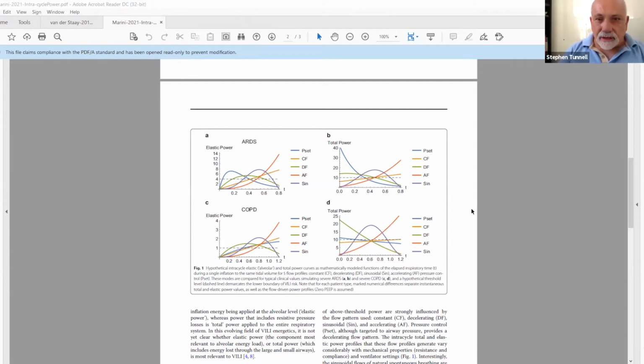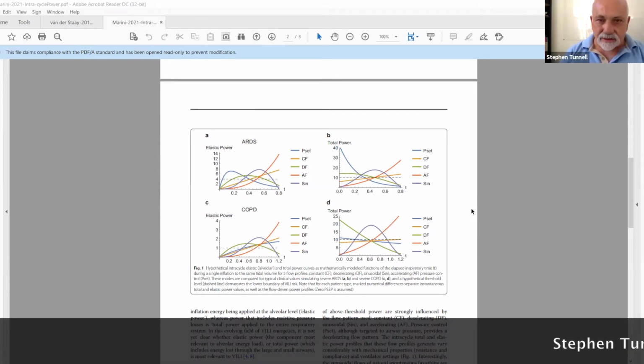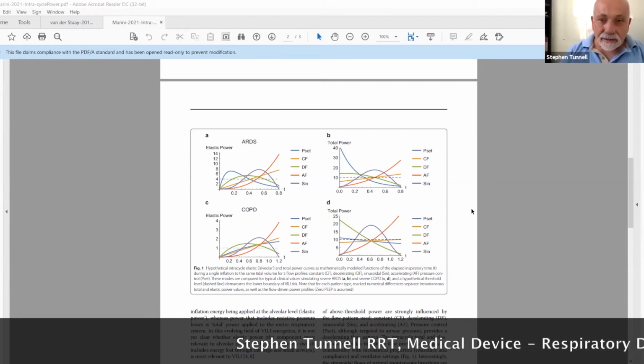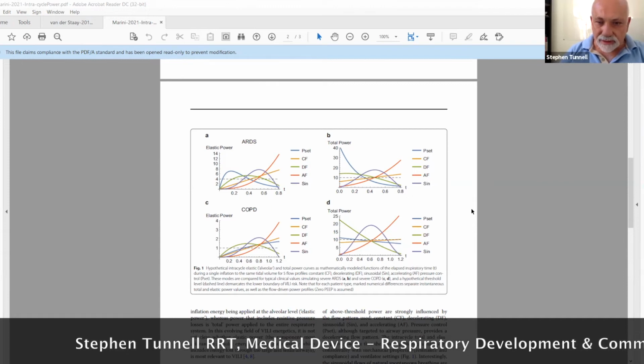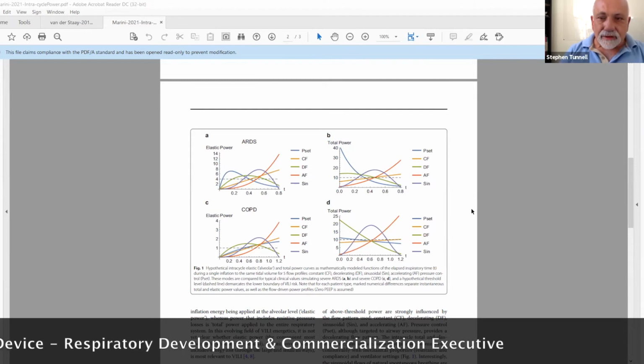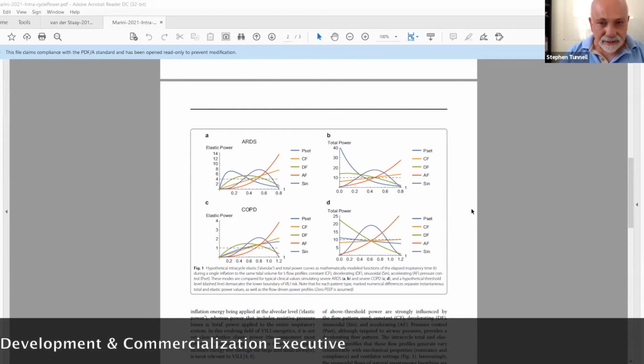Intuitively, I've always felt like at the early part of the inspiratory cycle, things were more forgiving because of the resistance of the endotracheal tube hub and getting through the airways. So I always had a tendency to use decelerating flow, feeling like early part of that phase. Now, next week we're going to have Steve Don join us, and some of the presentations he has put out there really caused me to think twice now about my old ways of ventilating.